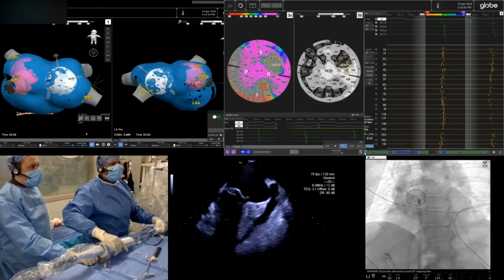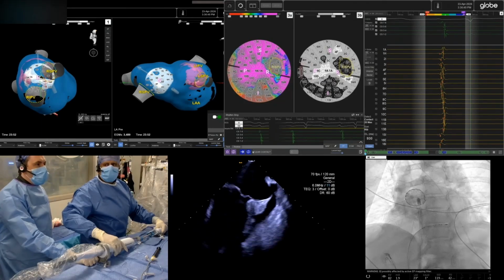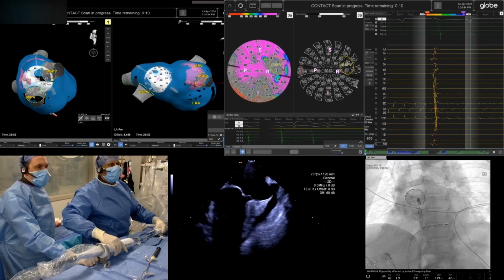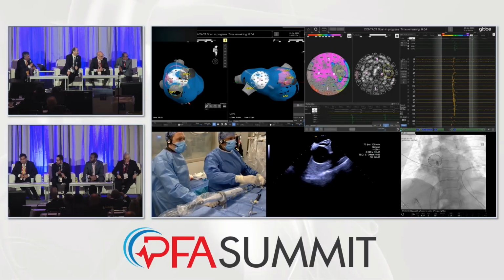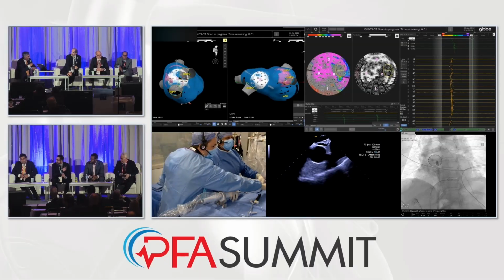Can I ask a quick question? I'm going to go after the RSPV first. So can we do a contact scan there, please? You can go ahead and speak. I was just going to ask, it certainly seems like an intricate system. How do you decide, as far as patient selection, which patients are best suited for this technology versus everything else that you have in-house?